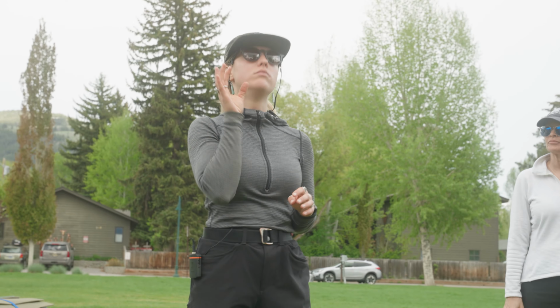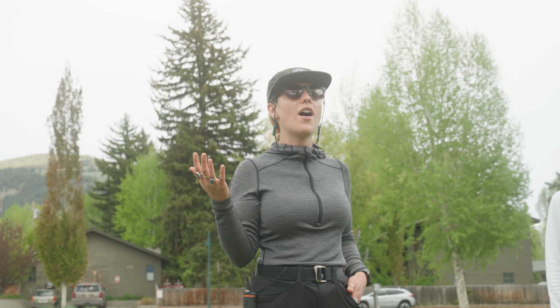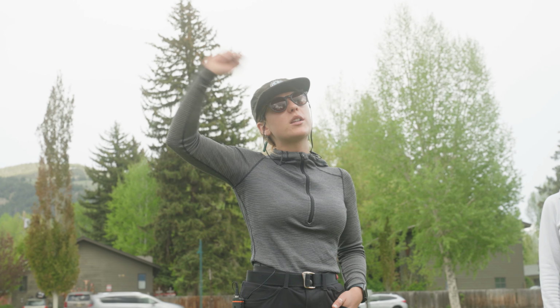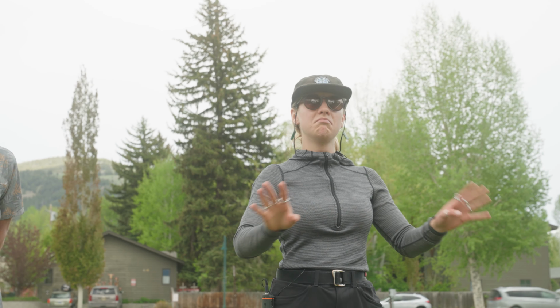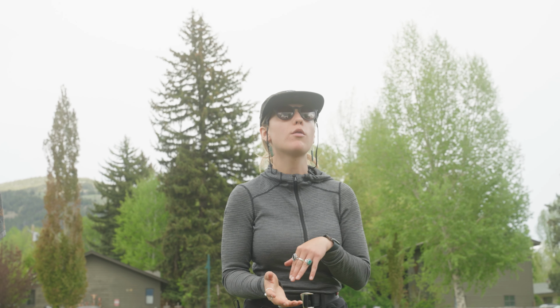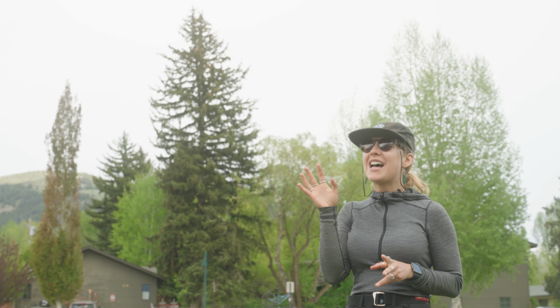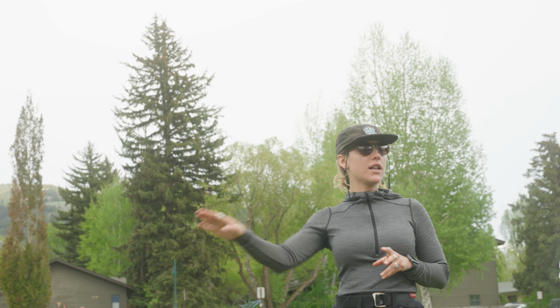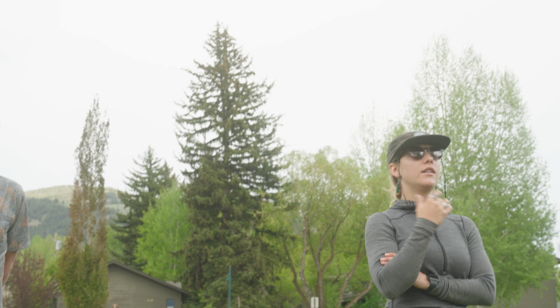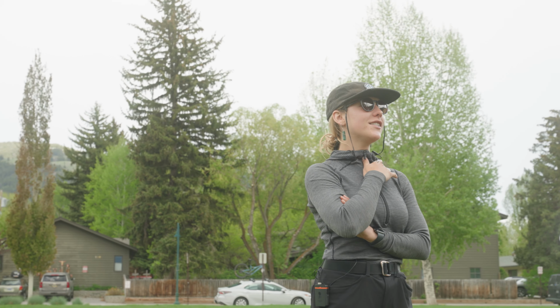Yeah, so generally anything that's going to get in your way, take it off. Absolutely. And we'll talk about helmet and backpack removal in just a second. But as far as hats, sunglasses, if they're going to impede your ability to smoothly roll the person, get it off, right? So let's upgrade this as far as being a little bit more preemptive before we roll the person. What would make that extrication of the patient a lot easier?